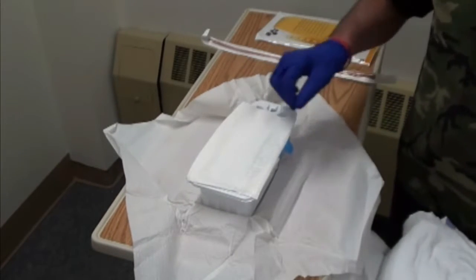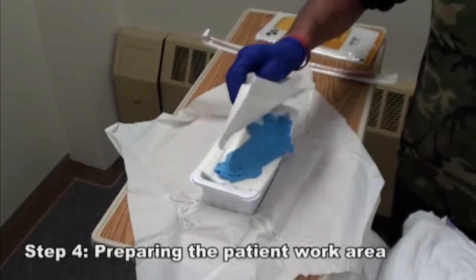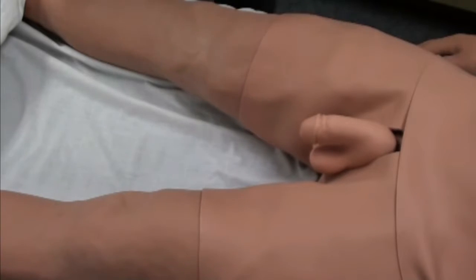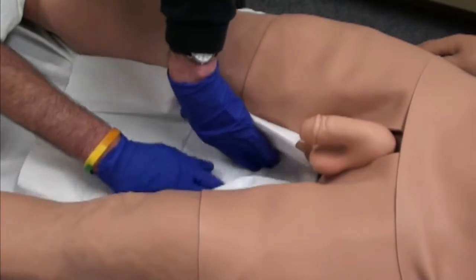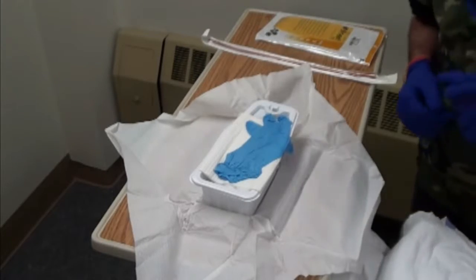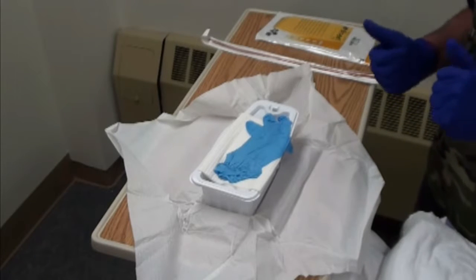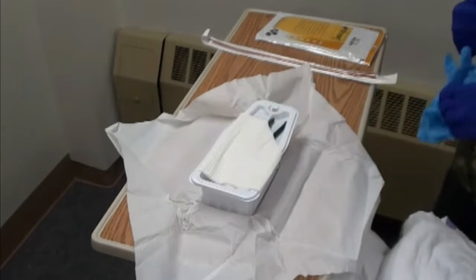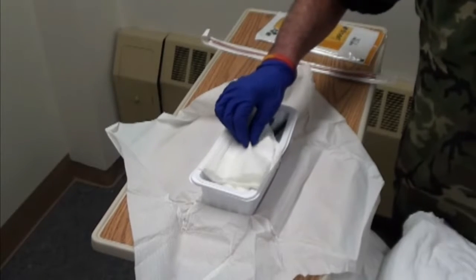Okay, I'm now going to place my drape with the shiny side down. I'm going to remove these gloves because I'm not going to need them, because they don't fit me, and I brought some larger ones for me. Okay, I'm going to now place the second die cut drape.